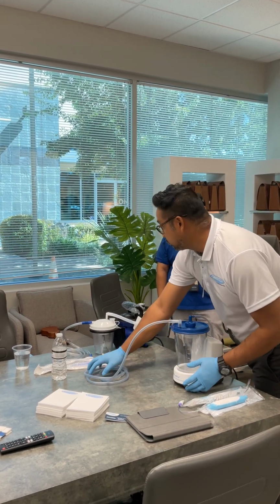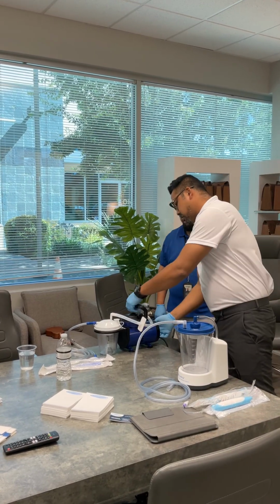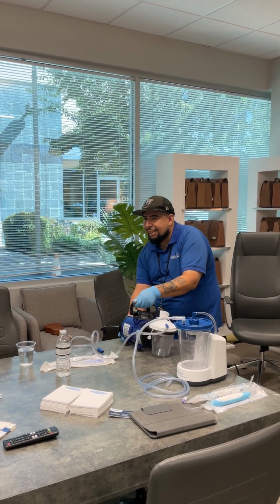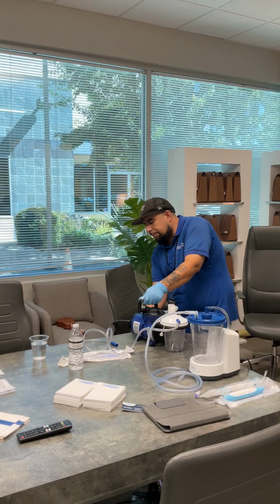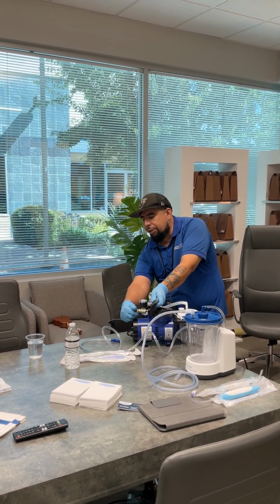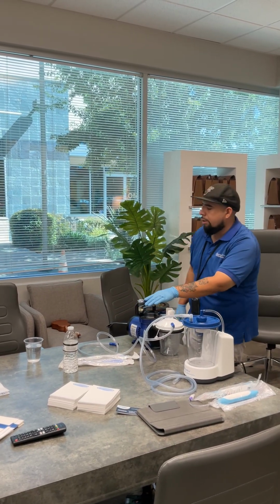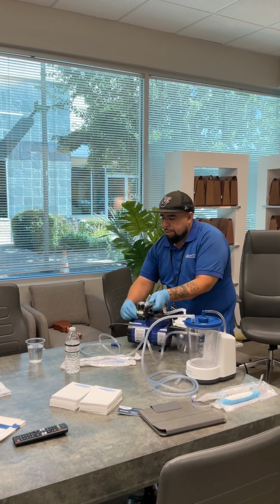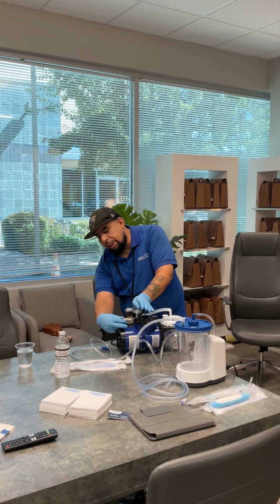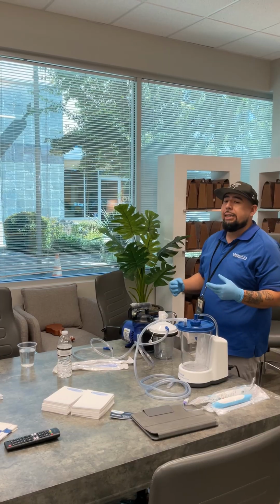For suctioning, is it only continuous, or can you do intermittent? This is continuous. There's an on and off switch right here. Since it's just oral, it's just going to be used to suck. This knob right here is going to allow you to adjust the suction power for oral suction. The farther this is out gives you the least amount of suction. Once you turn it in, that will increase the suction. It's recommended to always start out low and increase as needed.